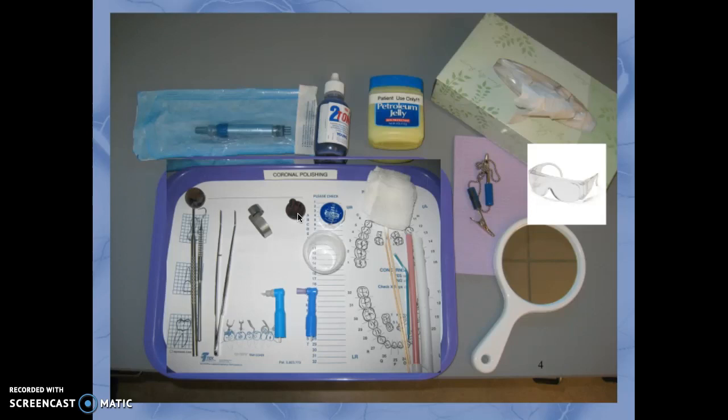For a very heavy stain you might want to use a medium or possibly a coarse abrasive. Usually a medium will suffice, and someone who has plaque but no stain would use a fine pumice. In most offices they go with the medium grade. The effectiveness of the abrasive is determined by the particle size and the amount of pressure applied to the tooth, which we will discuss later in the presentation.